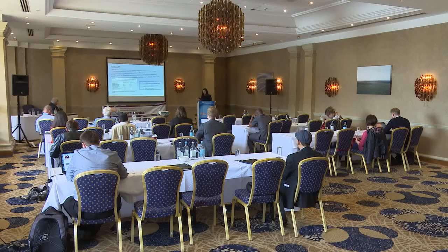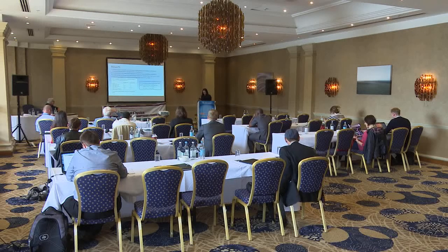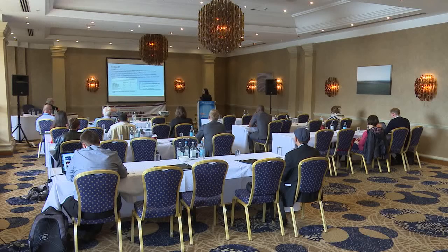And local DRLs were reviewed after 5 years. They had been established in our hospital. And in the sample of 20 patients, the average dose area product and fluoroscopy time were 2.54 gray in square centimeter and 2.1 minutes respectively. And the average weight for all patients in reviewed data was 74 kilogram. Dosimetric measurements and patient demographics in original and in reviewed data are presented in Table 3.